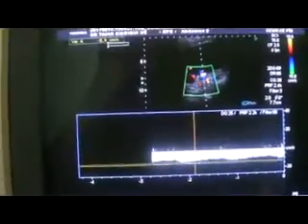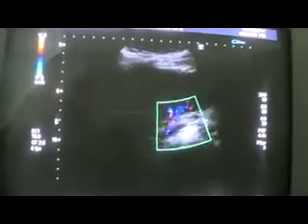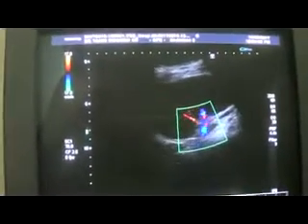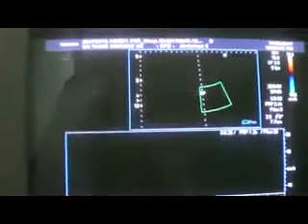It's an infarct. The velocity of the splenic vein is minus 11.7, and this is the splenic hilar region. You can see both the artery and the vein.